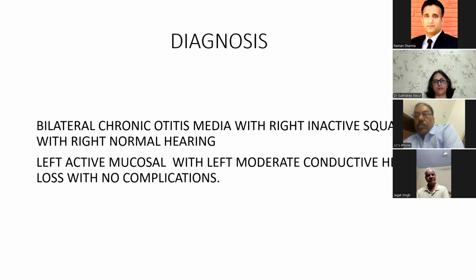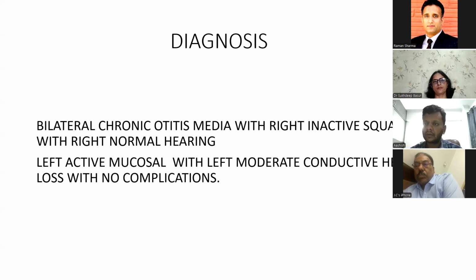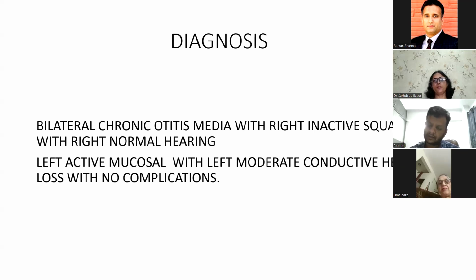You mean to say we have cholesteatoma around the ossicles? It doesn't look like cholesteatoma. You need to do a further thorough anatomy to see whether it is there or not, or we can have finer slices of CT temporal bone to comment on the possibility of cholesteatoma around the ossicles.